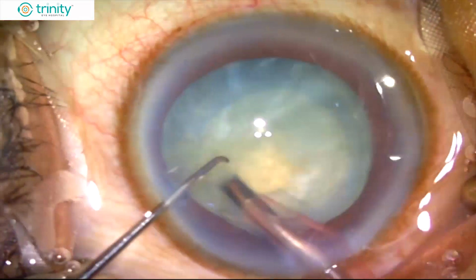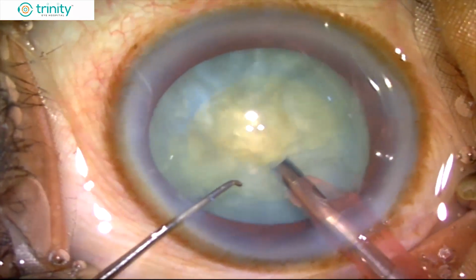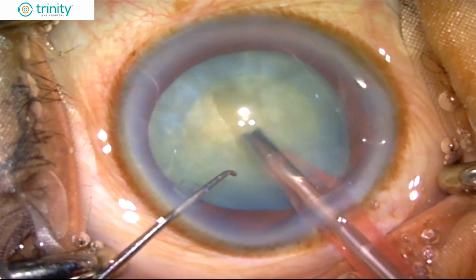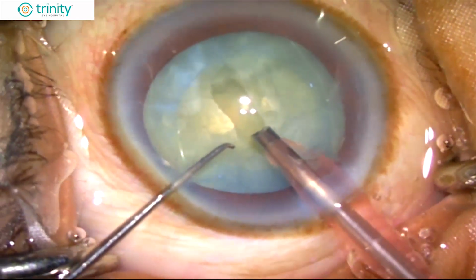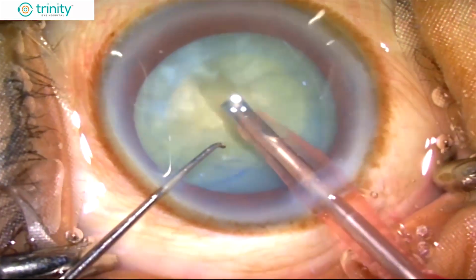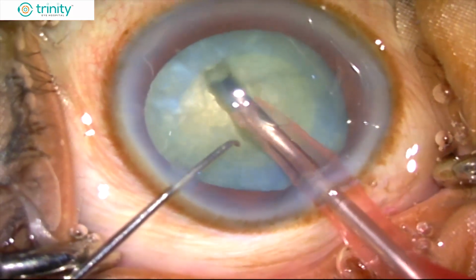So once it is mobilized, you can go for the trench. I don't do a full length trench. I concentrate my trench to the central area, so that is where the cataract is harder. So you don't have to really waste your energy trenching the peripheral area.